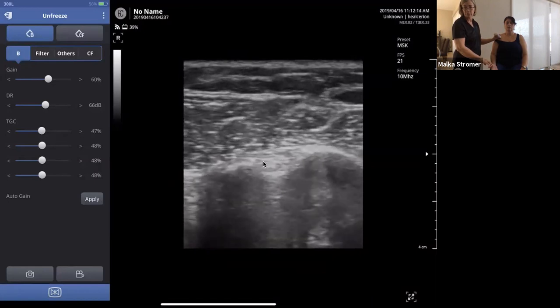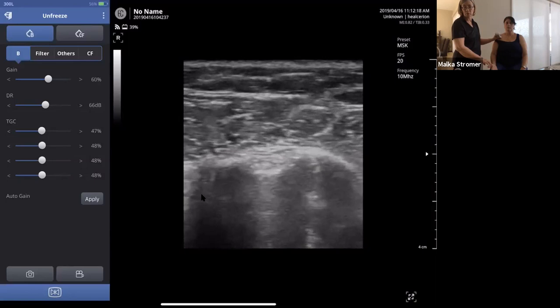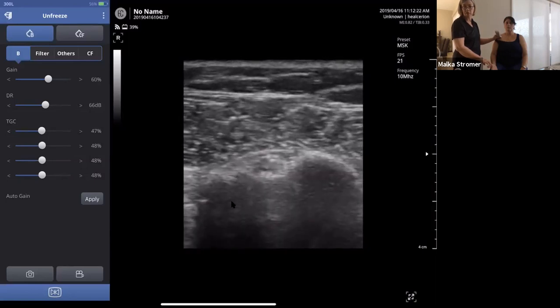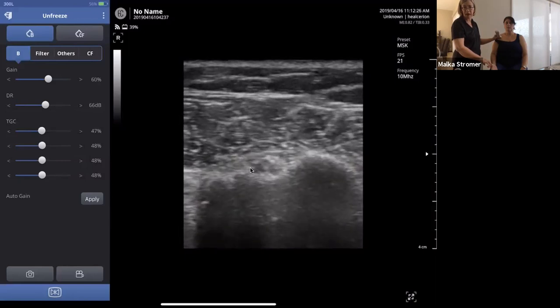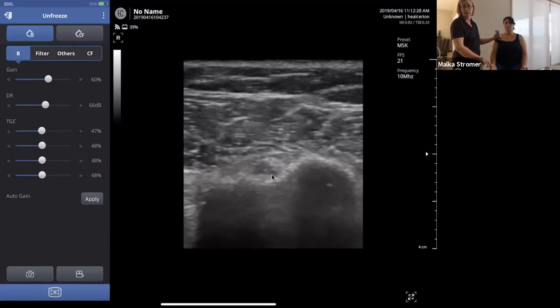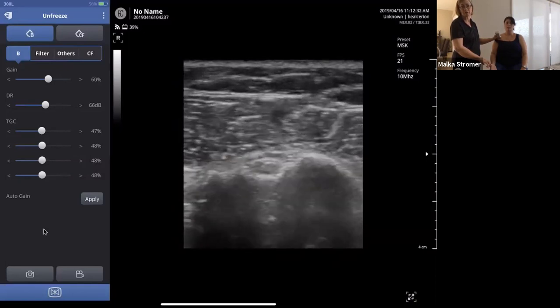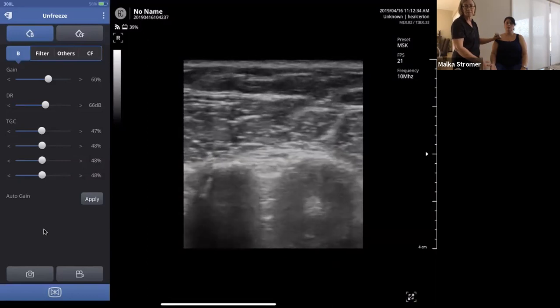Now, one thing that is unique to musculoskeletal ultrasound, and we learned this in the physics portion, is anisotropy. If we are not perpendicular to the fibers of the tendon, see how the biceps looks black? We're not on axis with that. So you can create pathology, which you don't want to do. The doctors don't like that.